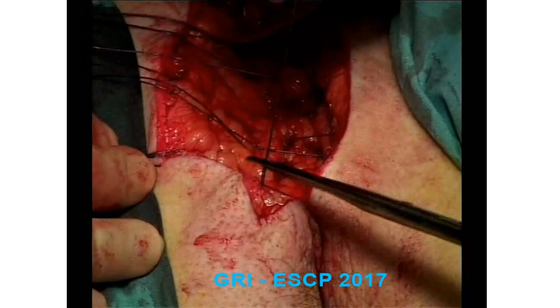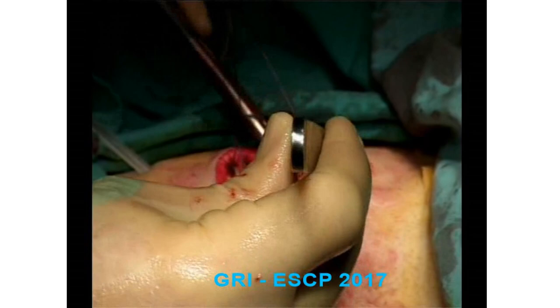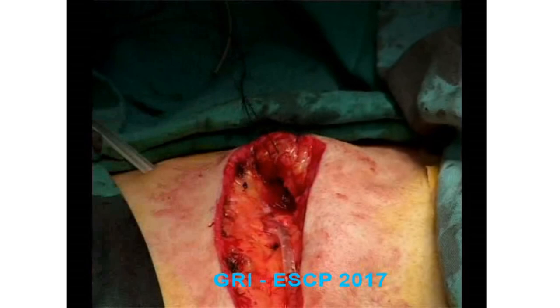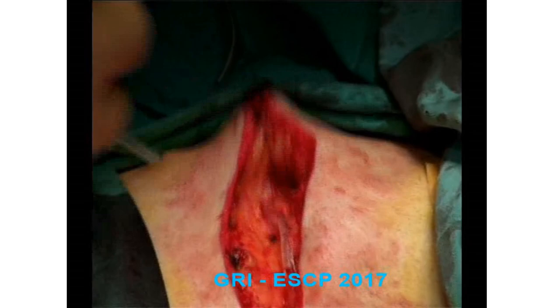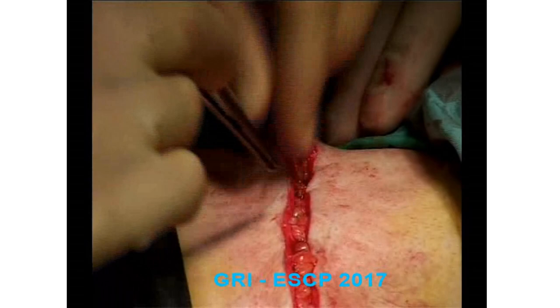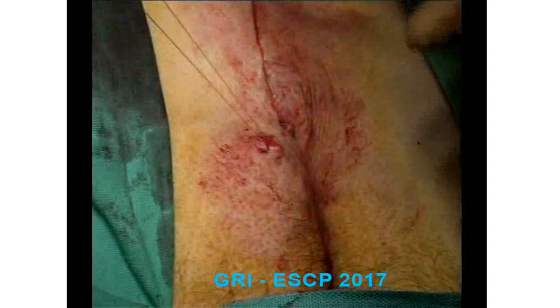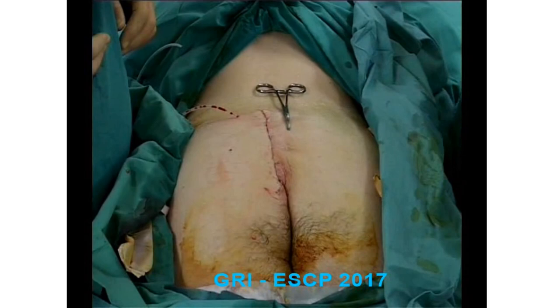The sutures are then tied. Prior to this step the wound is irrigated and 40 to 60 millilitres of 0.2% ropivacaine local anaesthetic is injected. The second layer attaches the free edge of the flap across to the other side. The superior and inferior apices are tied, as are all other sutures, then subcuticular closure is performed followed by a hydrocolloid dressing. The patient is discharged on the day of surgery and followed up in clinic two to four weeks later.